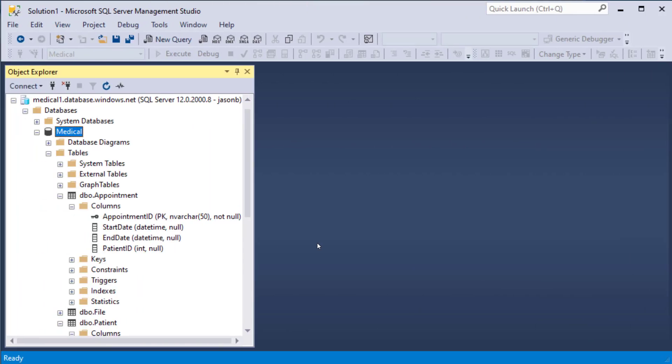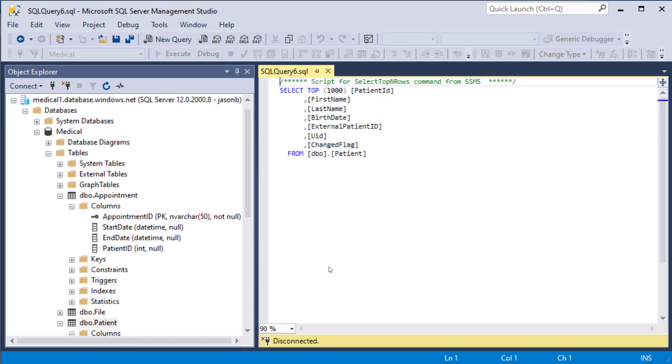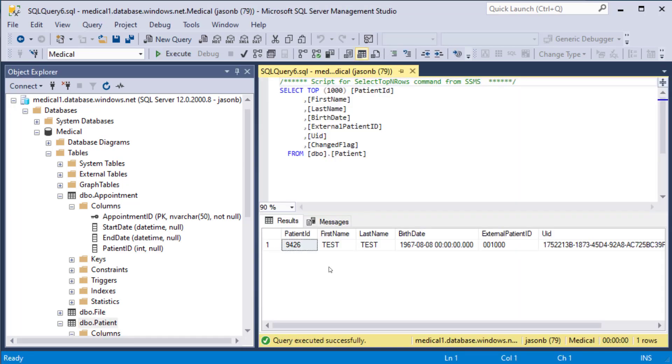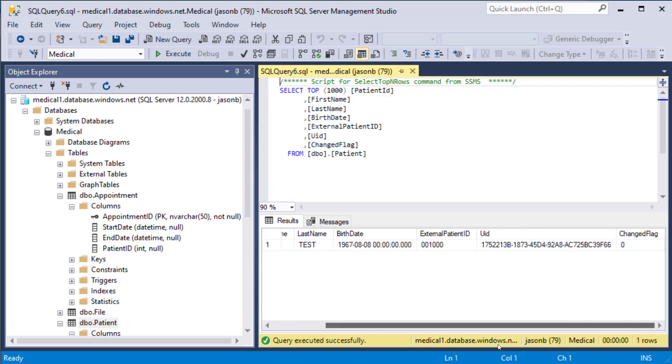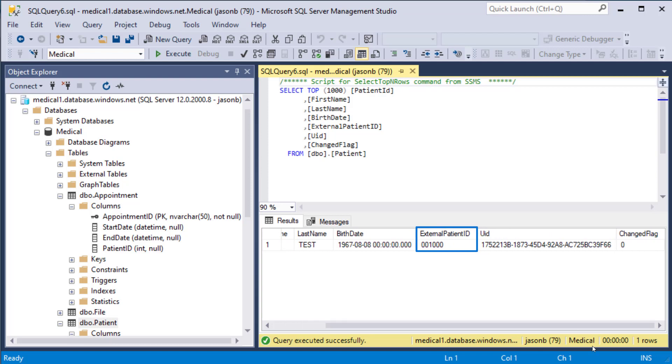So I'll bring up SQL Server Management Studio and find my table. I just wrote to the patient's table. So I'm right on that and select the top rows. And there we go. Our message was written to the database with the values that we wanted. Some quick things of note. The patient ID is an ID generated inside the database. So we're going to try and return that back to our message. And we're going to use that again when we create the appointment. So it's the database's patient ID. And we're treating the incoming patient ID as the external one, right? Because that's coming from another system.